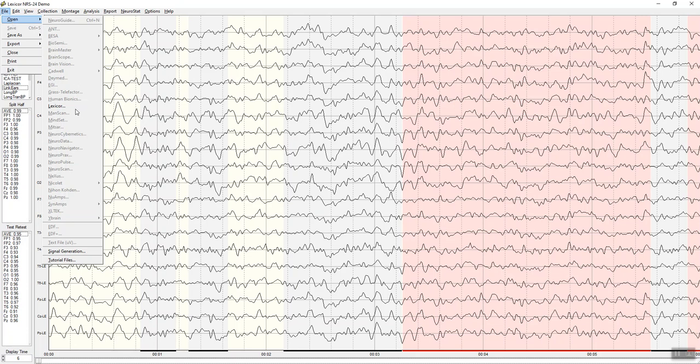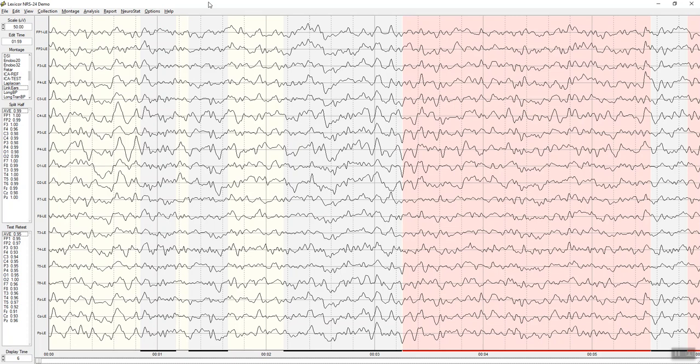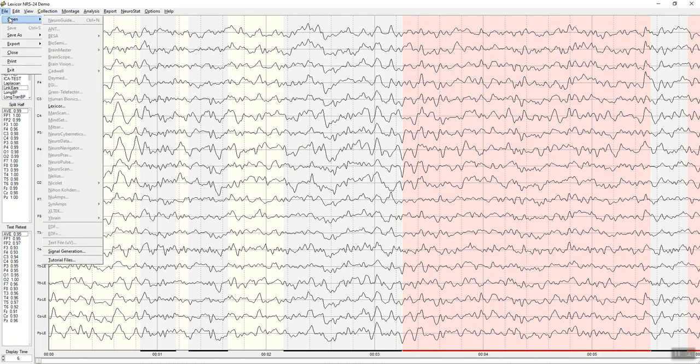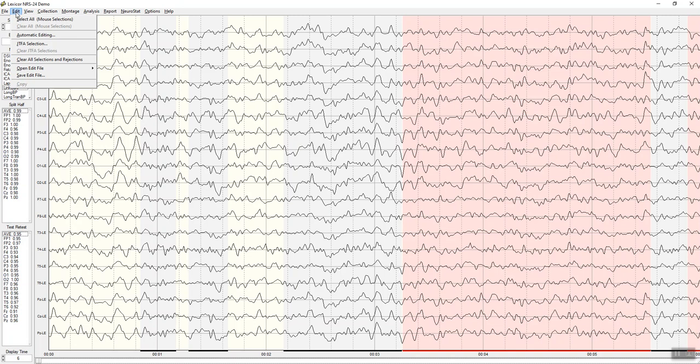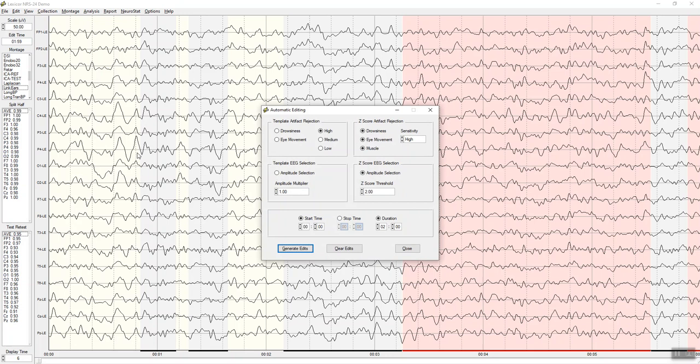I've opened up this Lexicor acquired EEG data from a 55-year-old individual who was struck in the right parietal lobe by a bat. He was assaulted and I brought the data in after I make selections, which I have done using the edit key here under automatic selections. You can select by hand just by selecting artifact-free sections or you can use the comparison to joint time frequency analysis instantaneous normative database. I started at zero seconds and I'm getting two minutes of data, but you can determine your start stop time and the duration of selections you wish.